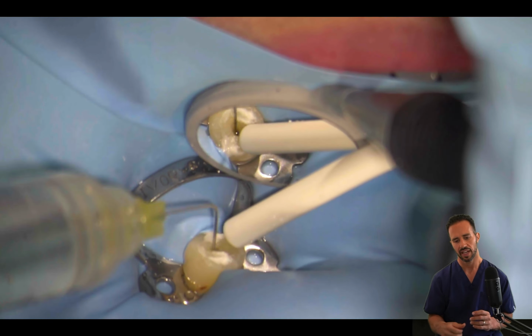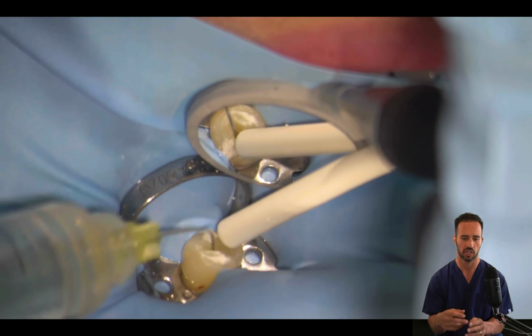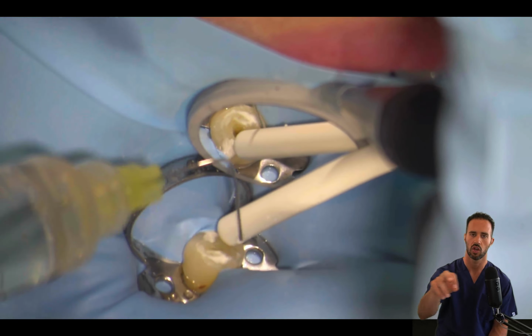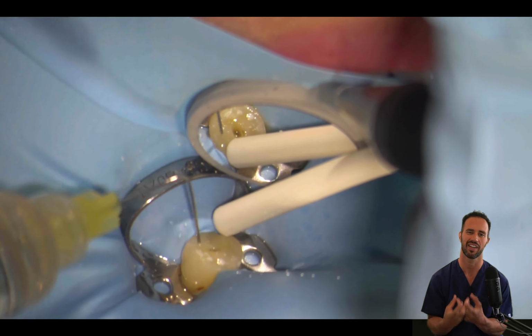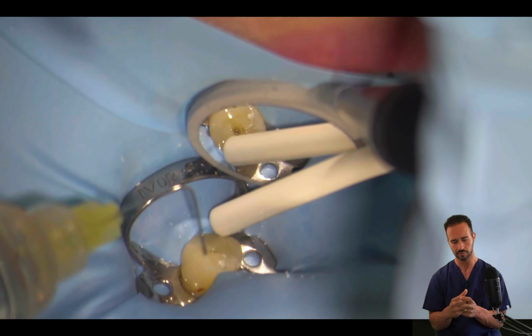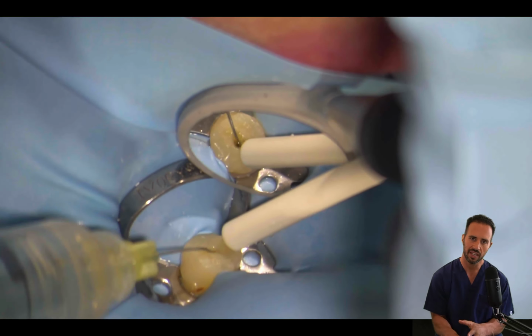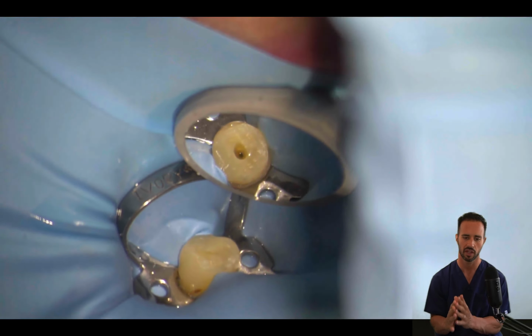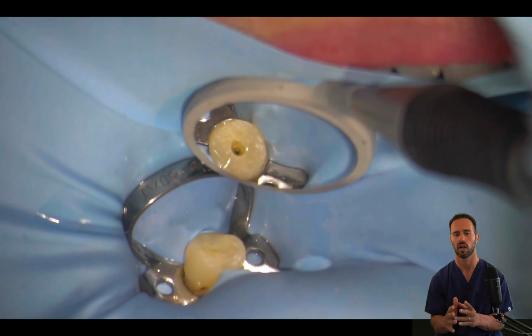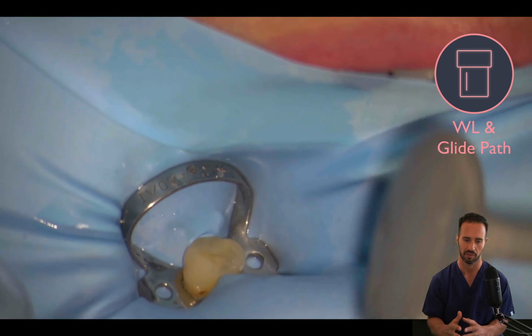Okay, and if you get some debris, don't be shy about putting some hypochlorite along the surface of the tooth just to dissolve that debris and make sure we're working with a nice clean area. Okay, so now we can see that we're in the canal. We have a nice initial shape in the coronal third of the root. Then we're going to proceed to our working length determination and our glide path preparation.